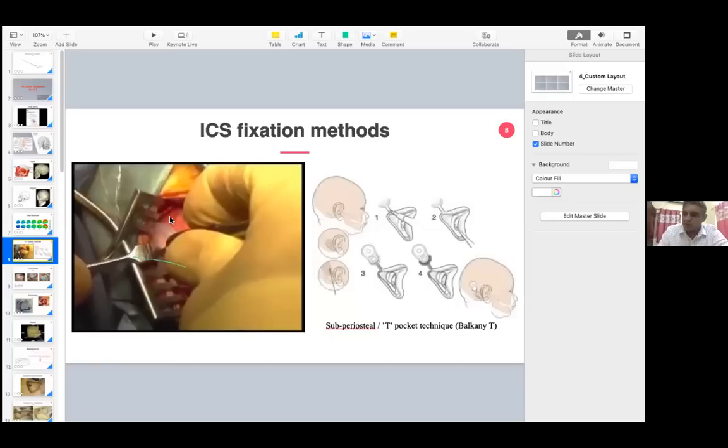Number two, if one has manipulated the suture line and it has slipped off, in a growing skull there would always be fibrous adhesions between the soft tissues and the implant receiver stimulator that would prevent the migration.